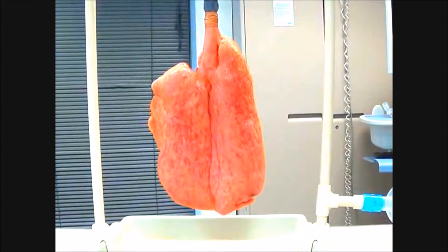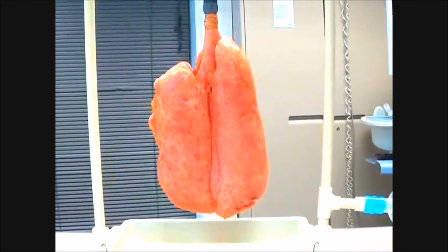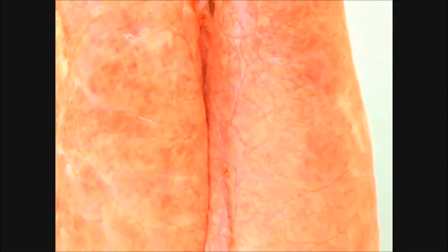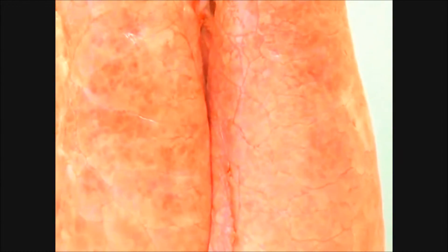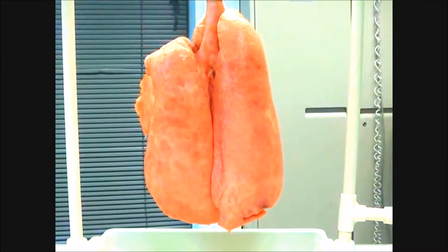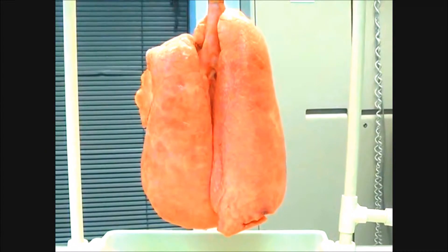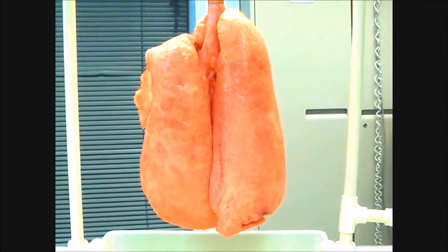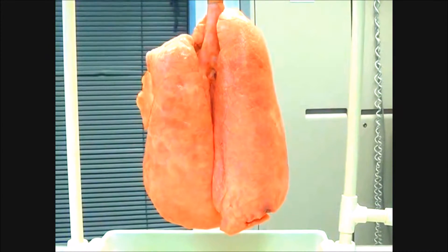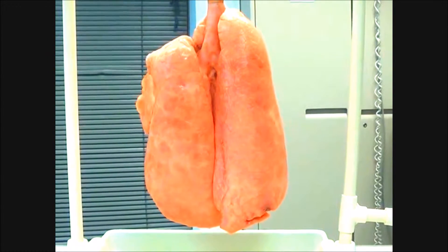On the first breath, you saw me recruit and you did not see it de-recruit. This is worth a thousand words — that little PEEP valve that took two seconds to place on there, look how much of a difference you can see visually. It's just astonishing how much a one-way valve spring makes when ventilating. I'm ventilating the exact same way I did before, same tidal volume — the only difference is I have my PEEP valve on.